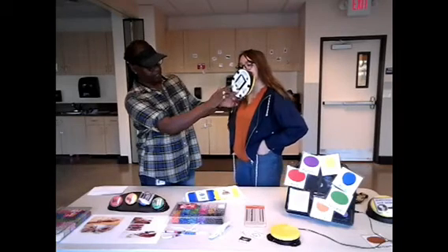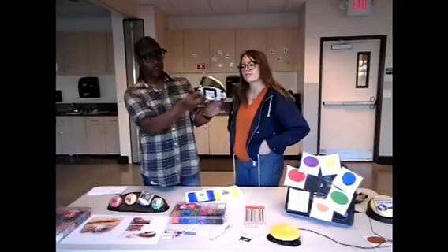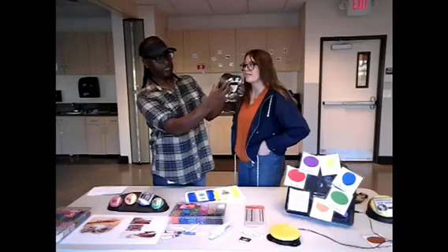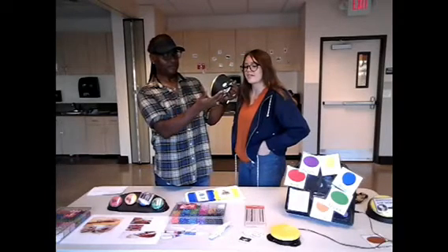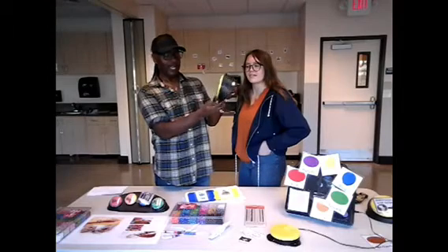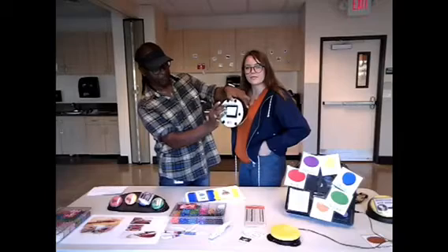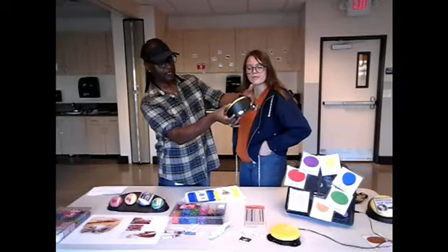Basically here, if I turn this switch on, and I press this switch in the back, which is the record button, all I have to do is hold the two together and speak into the device. Mickey. And that's the response you get. And if you want to clear that, just hold the record button and the top button, and it should be playing.